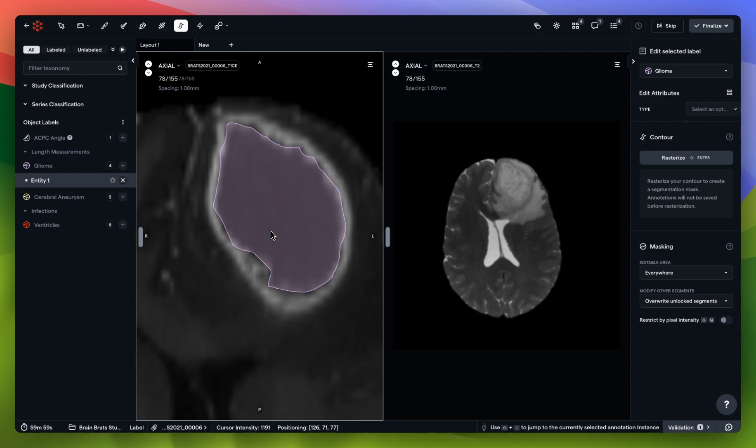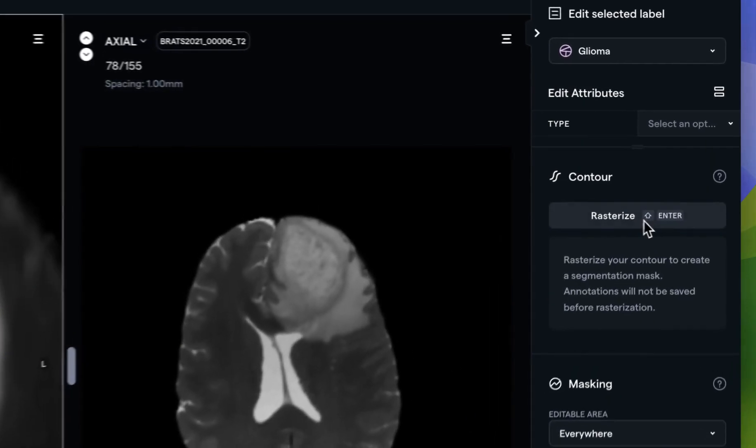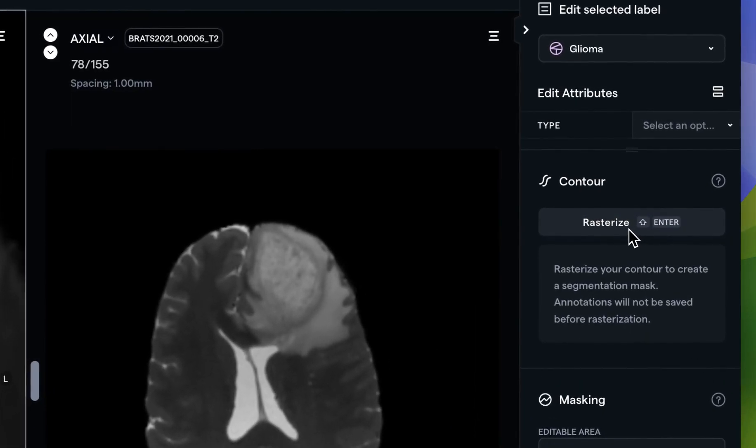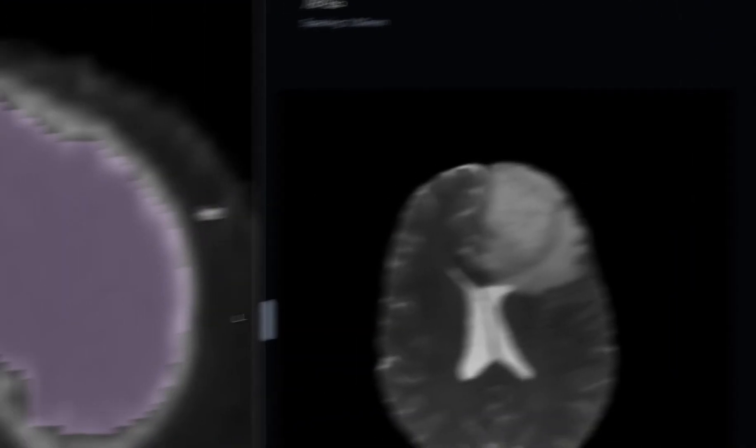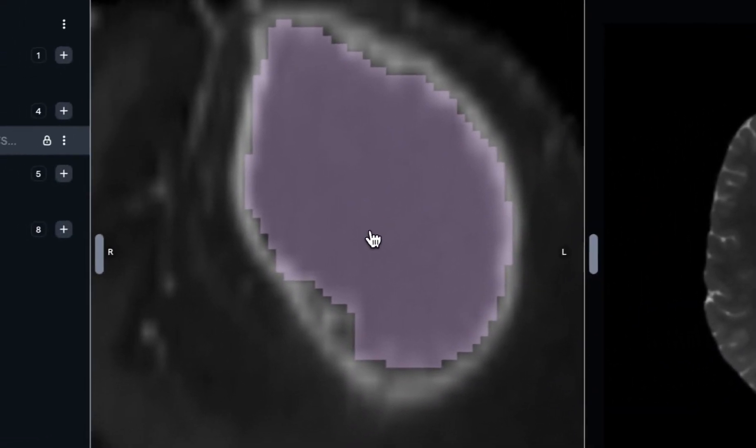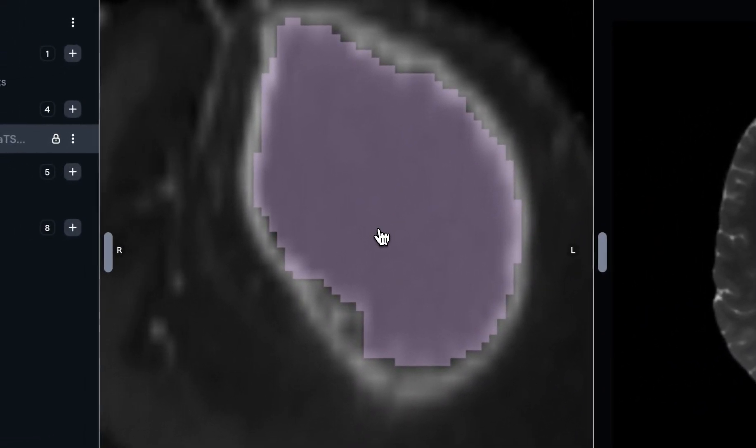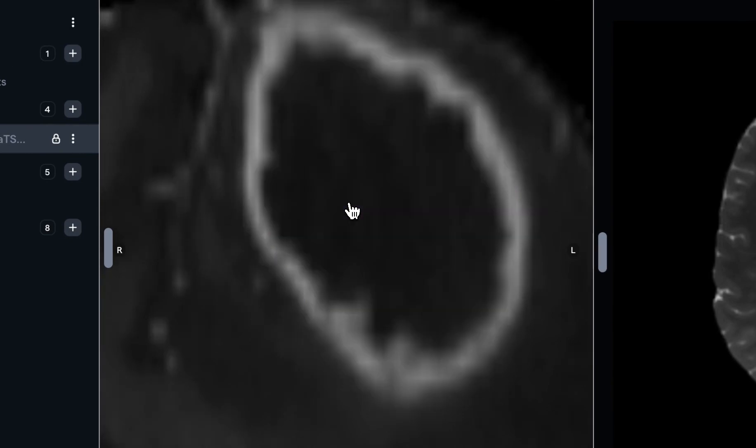What I can do at this point is rasterize this contour by clicking this button or using the keyboard shortcut, and you'll see that my segmentation mask is applied. If I want to do 100% manual segmentation, I could go up one slice and just continue this flow until the end of time.